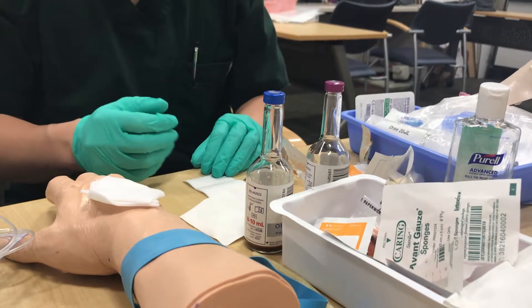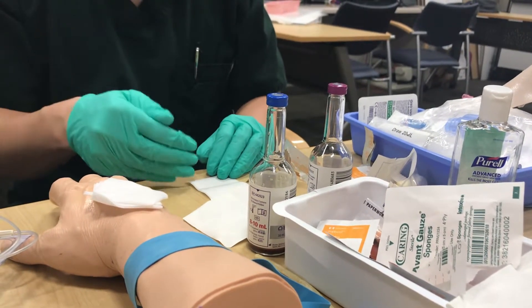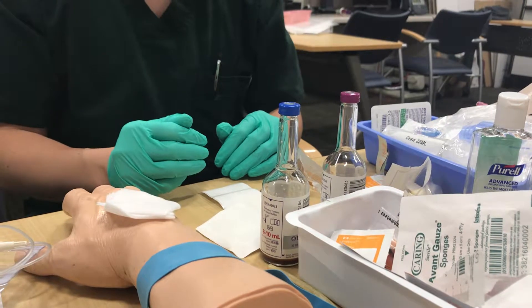The site is very important to include on the label. Also make sure that the blood culture bottle numbers match — if you have blood culture one, make sure both bottles are labeled blood culture one, not blood culture one and two. It's very important to match those up, otherwise you're probably going to have to redo it.